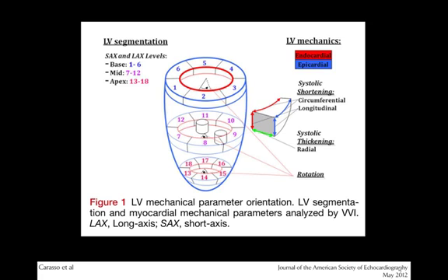So I am going to show this because it's a reference that came out in May last year, so it's very recent, and I love it. This group basically examined a very healthy number of patients and tried, with different equipment, to actually quantify both the longitudinal strain measures and also the short axis dimension.